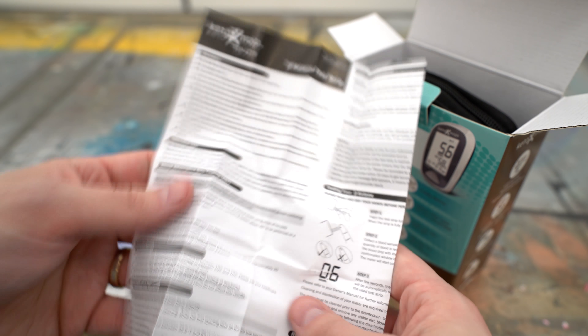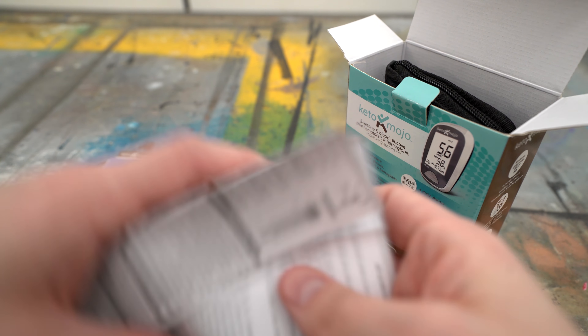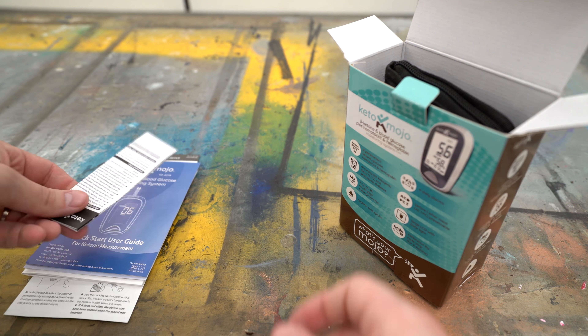The next thing I found in there was the testing strip instruction sheet, so it gives you some ideas of how to use the strip and how to collect the actual drop of blood so that you can get the most accurate reading possible.